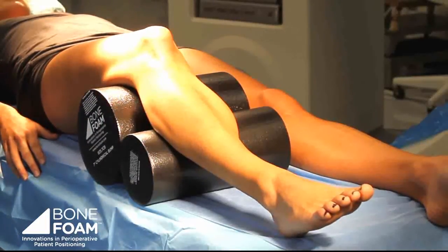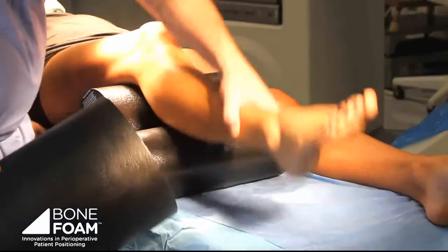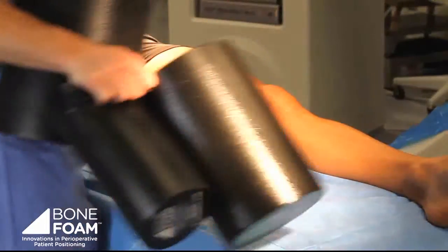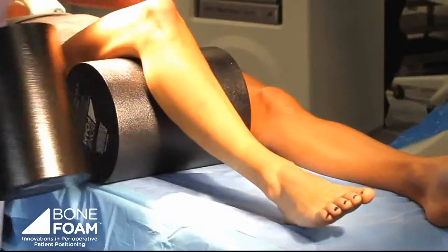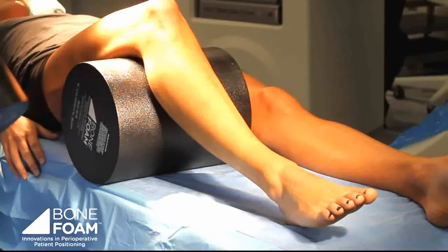Here is the larger bump. Now the bumps are very important reduction devices. I'll demonstrate why. If one has a femur fracture in this region, in order to reduce the alignment of the femur fracture, one will want to adjust the bump perhaps to fit right under the fracture to support it appropriately. So this bump here is doing the reduction of the femur fracture.